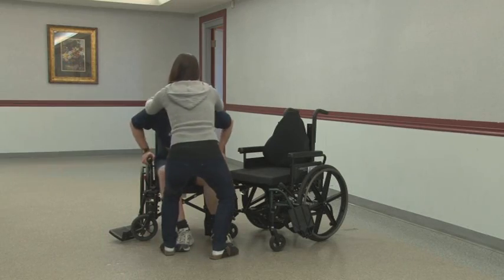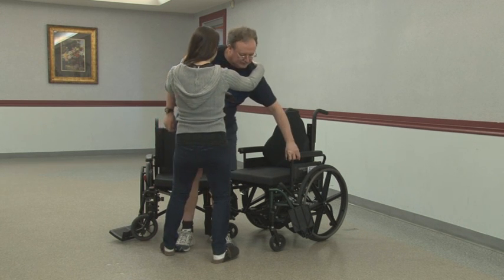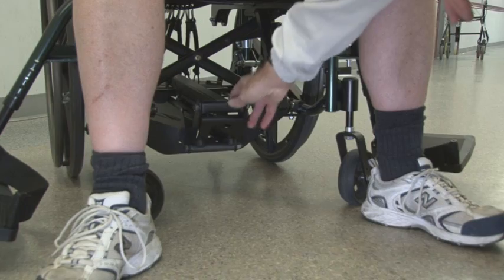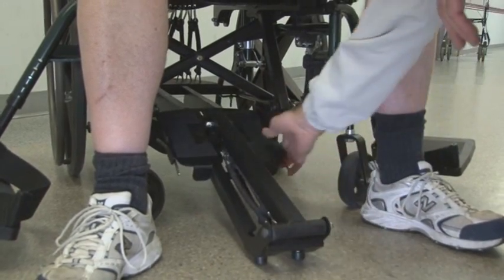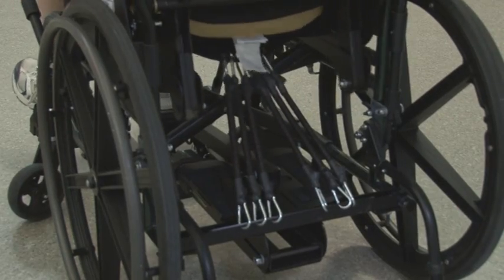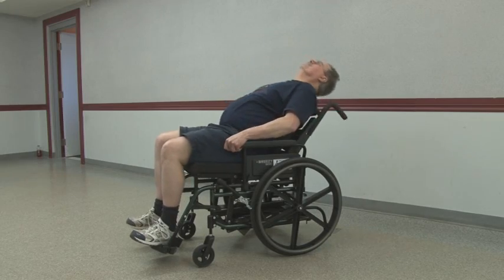The exercise wheelchair is easy to transfer to. The leg apparatus is stored underneath the seat and folds out easily. The bungee resistance is adjustable for both the trunk and lower extremities.